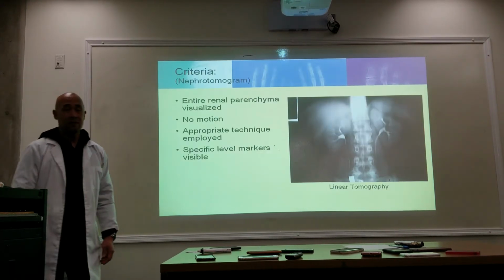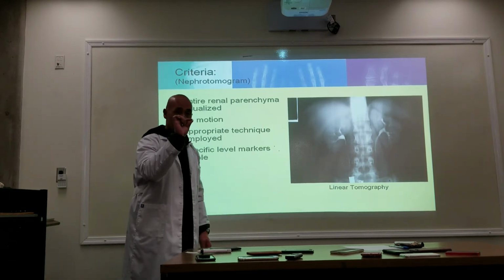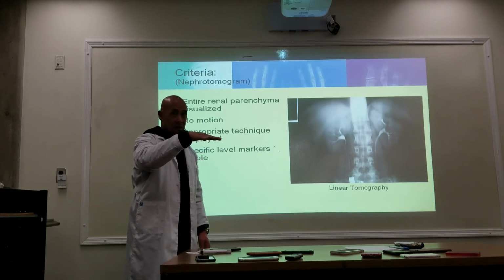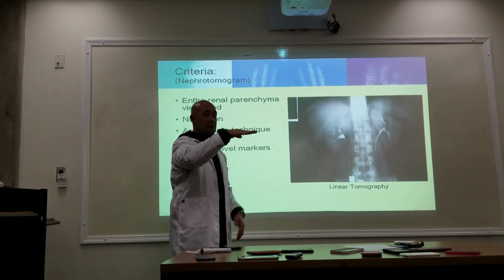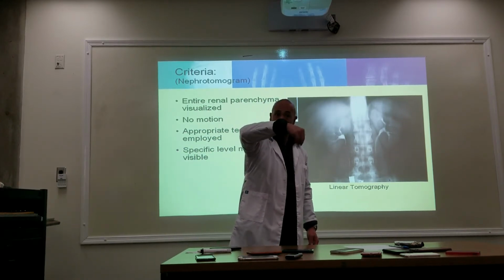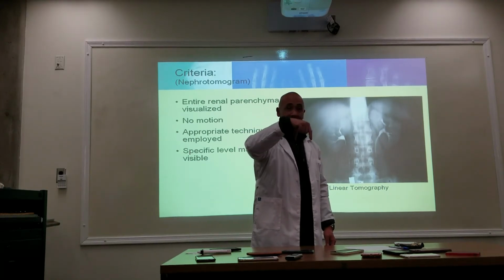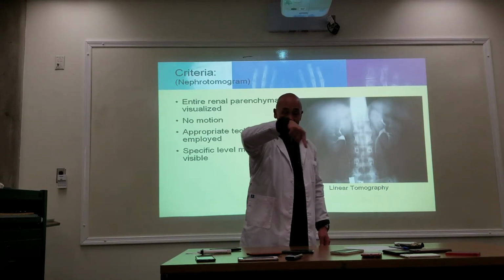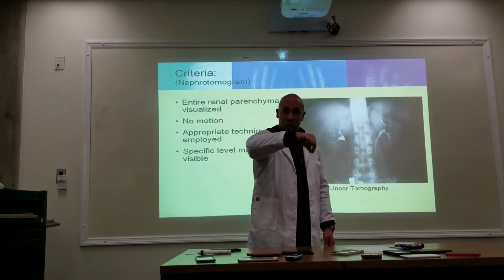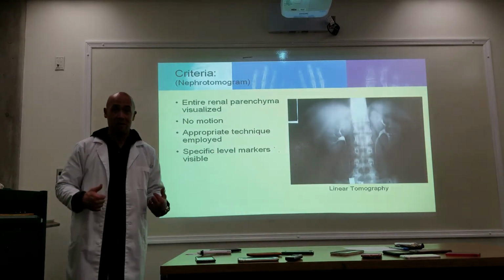So only the fulcrum point is clear, everything else is blur? At the fulcrum point, it's clear. So only at that level, anything that's above and below is blurred. Because look, let's say you're spinning a top, okay? What stays focused is the middle of that spinning top, but everything around that is blurry. So that middle is your fulcrum point, which stays more focused than the periphery.